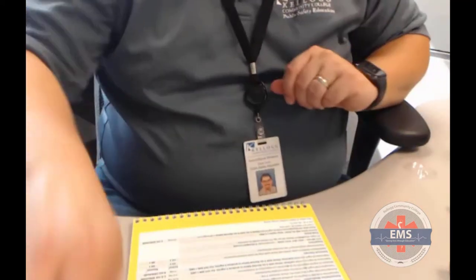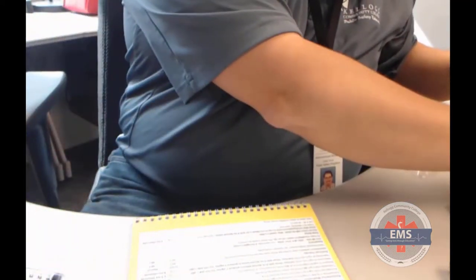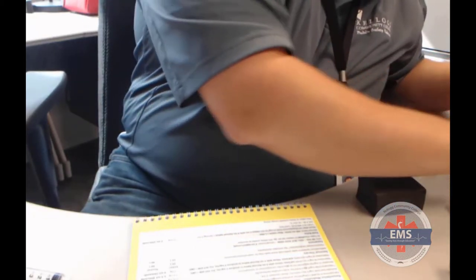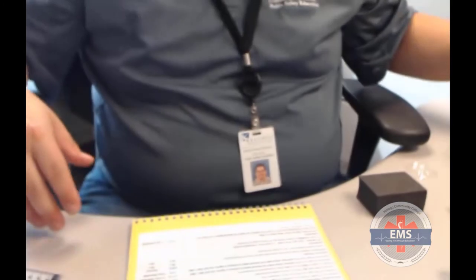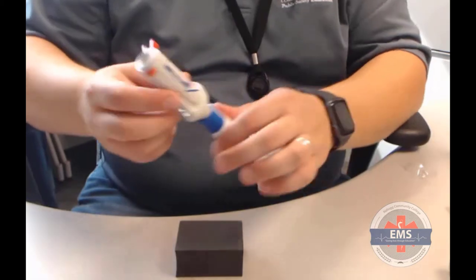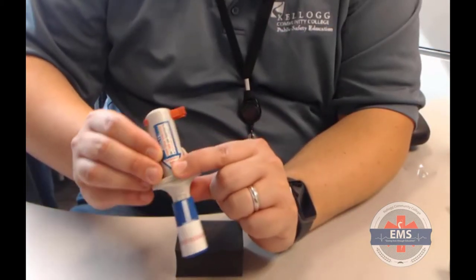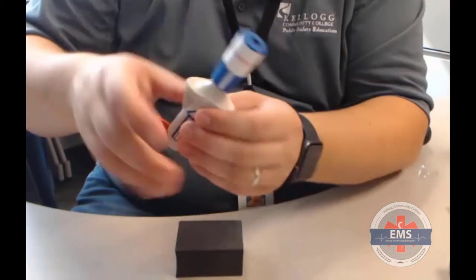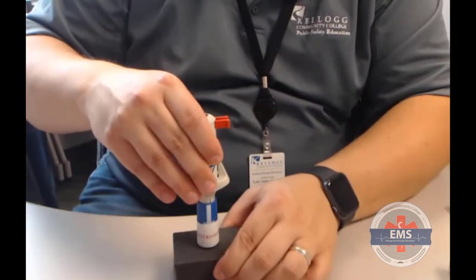The big I/O gun here, which you can actually go ahead and use, does come with some instructions, right? Nice fancy instructions. Nothing crazy as far as that goes, but it is important that we have an understanding of how that works. In this case, this is for training purposes only. You've got to make sure you read the directions. You don't want to put your hand here and push this down. It's going to shoot right up through your palm. That'd be real bad. We don't want to do that.